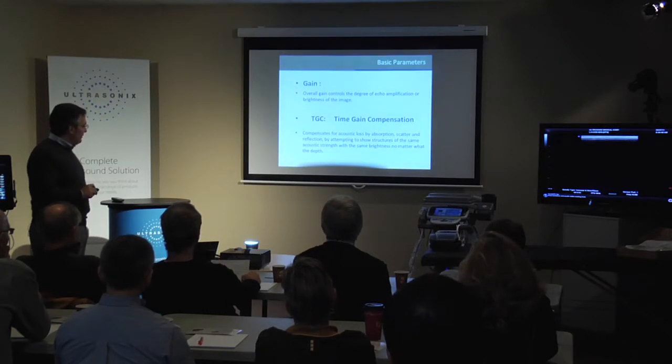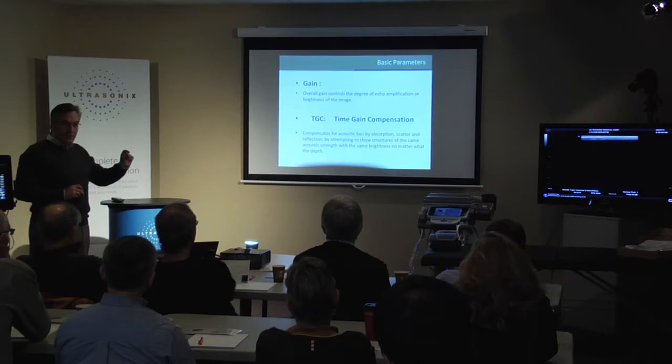The time gain is, again, individual aspects of the image, near, mid, or far, can be individually chosen or enhanced or reduced to better the image on that given choice or region of interest.